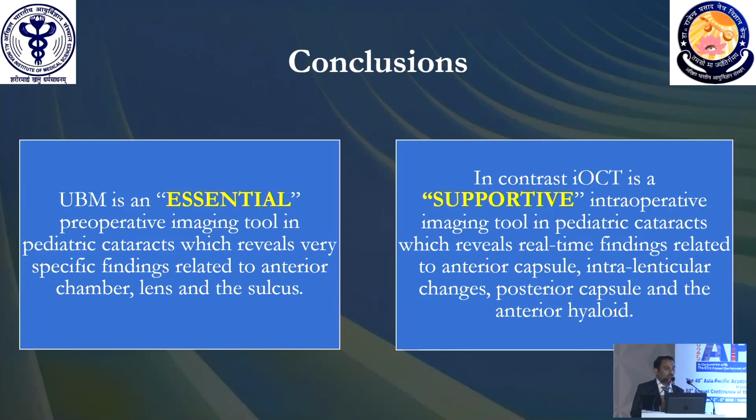It's going to support your findings. It's going to be supportive during your surgeries. It is going to give intralenticular details, anterior capsular details, postcapsular details, and the anterior hyaloid details in a micro form. UBM is going to be in a macro form or a larger view.